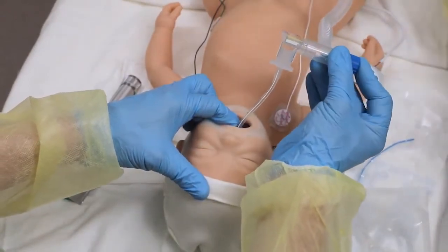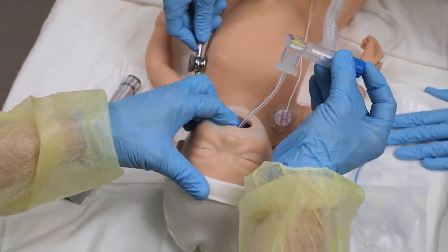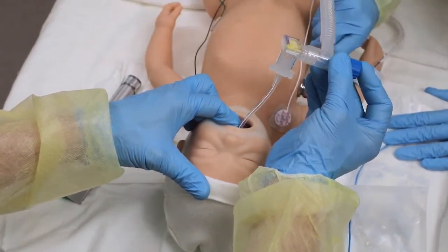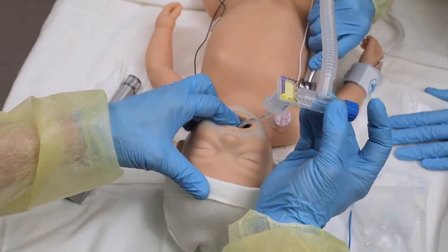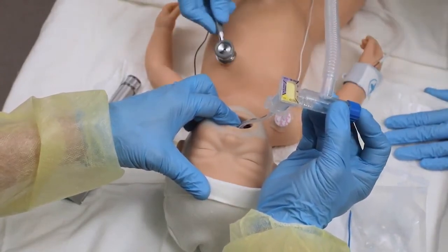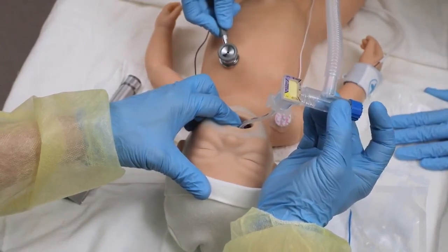The assistant checks tube placement by listening for a rising heart rate and noting color change on the CO2 detector within 8 to 10 breaths. Other indicators include bilateral breath sounds in the axilla and symmetrical chest movement.